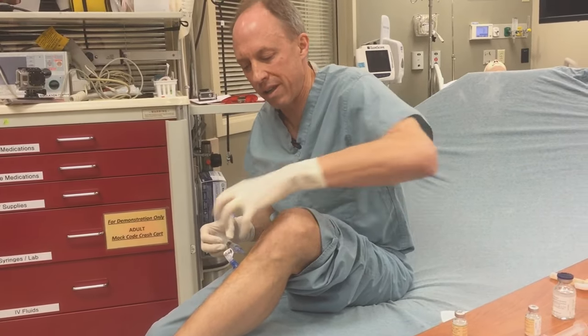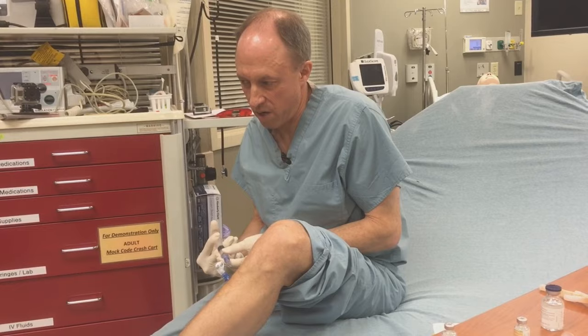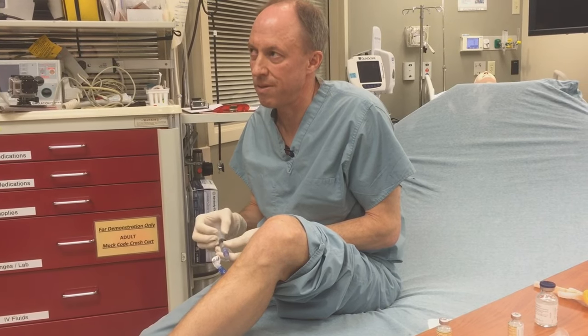I can feel it all throughout the top of my tibia. How much have you given yourself? Two mils. And what would you equate your pain to right now? Five. Like if you strike your shin on a hard object, it hurts pretty bad. I mean, it hurts, but it's certainly tolerable.